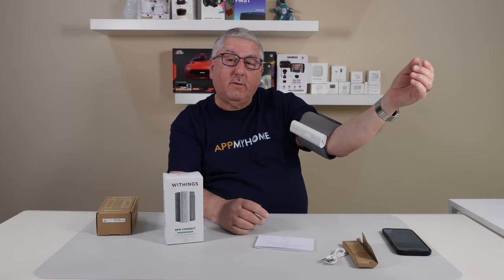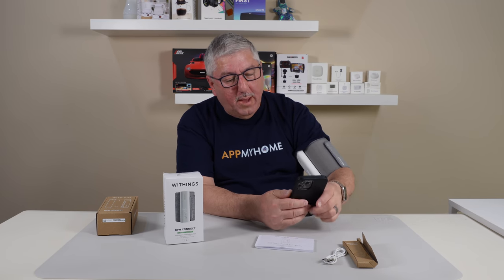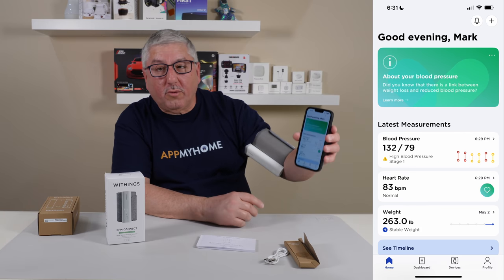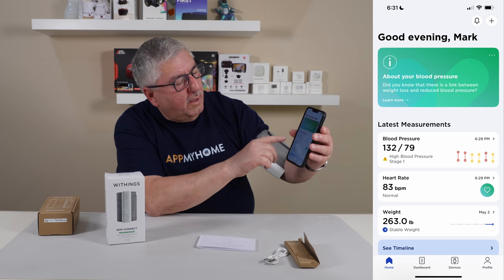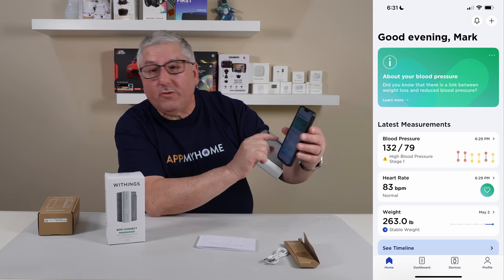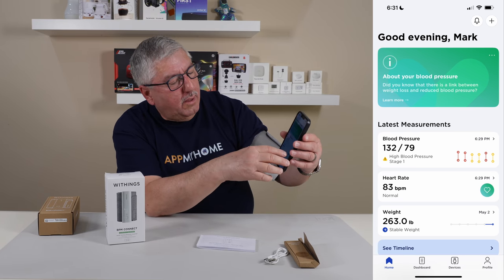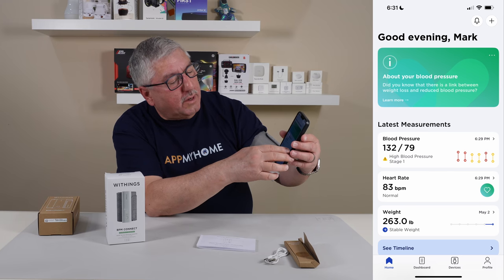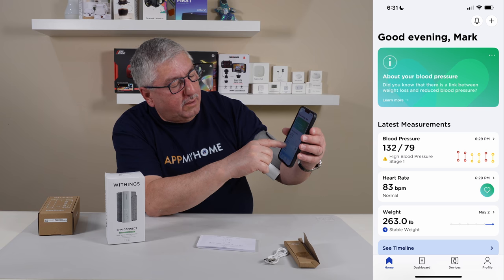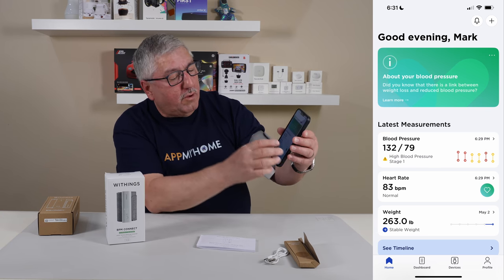Now what it's doing is sending it over to the app. If we bring up the app and refresh the screen — okay, I did a refresh. It takes a little bit for it to come across, but it's 132 over 79. It says that is high blood pressure stage 1, so it gives you these warnings along the way. You've got to go by what your doctor says, of course, but it's keeping track of it. It shows my heart rate is 83. It works pretty good and keeps track of everything that's going on.